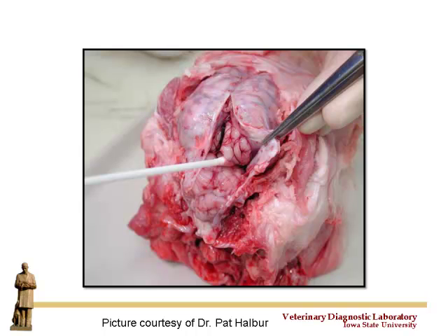If you decap, or take the cap off the skull, you can take another swab as you're taking the meninges away. Usually somewhere right around there, you'll find some nice suppurative inflammation potentially as a swab to culture. This way we get away from searing the brain and also potentially having the correct media for those more fastidious organisms like Haemophilus parasuis.